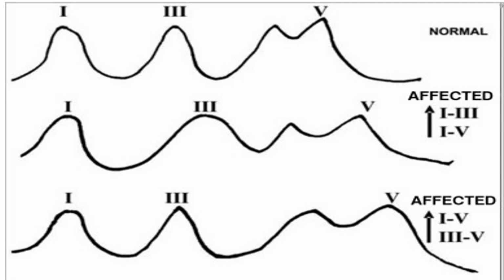Okay, so increase the distance, increase the latency, and also there is flattened peak of these different waves. That means reduced amplitude. So all these abnormalities indicate towards a pathology. Okay, so this was the image depicting the abnormal waveforms of BERA. Now let's proceed to the otoacoustic emissions.